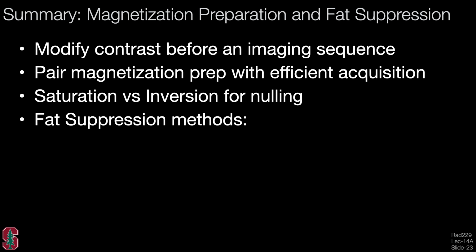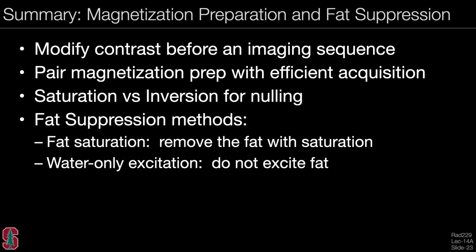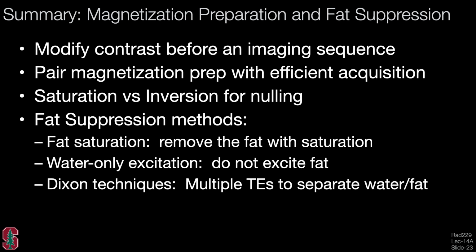And then we looked at some fat suppression methods. These included fat saturation, where we remove the fat using a saturation. We do water-only excitation, where we simply do not excite the fat, but rather excite only the water signal. And we looked at Dixon techniques, where we use multiple echo times and the combination of these to separate water and fat into different images.